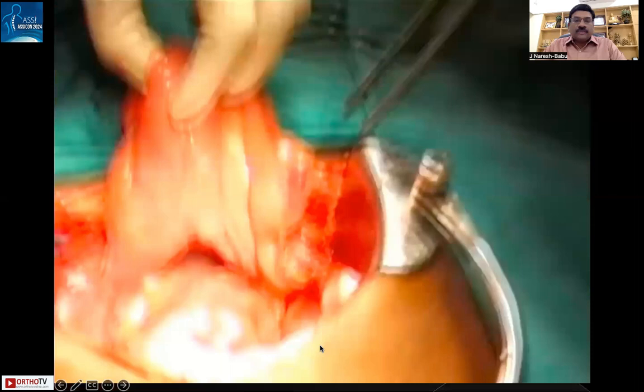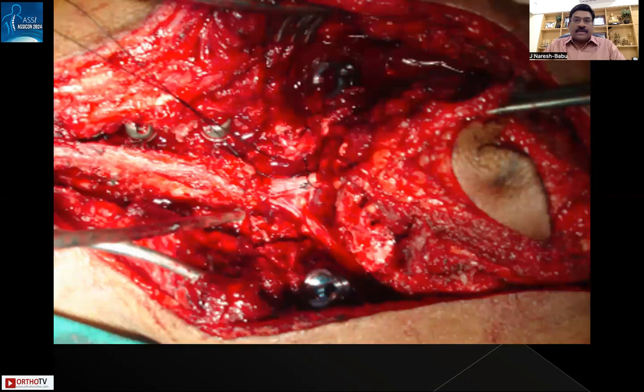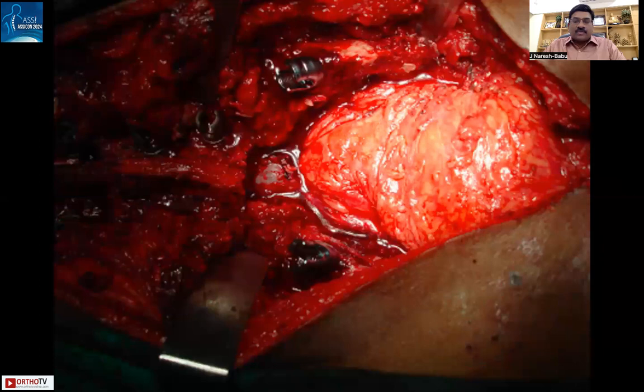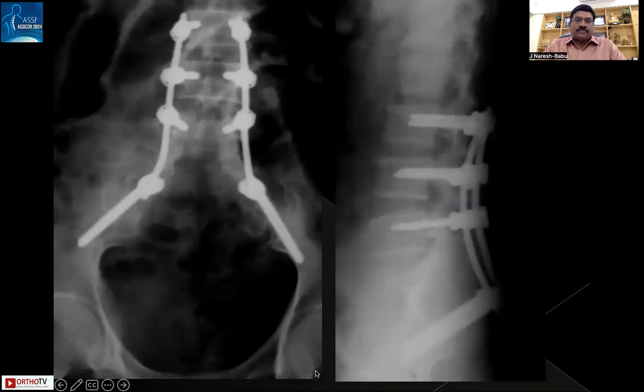Posteriorly, after exposure and placement of bilateral pedicle screws, the tumor along with the biopsy track is separated. The critical step is ligating the thecal sac to separate the tumor from the spine. Once this is done, iliac screws are applied so that spino-pelvic fixation can be completed and the entire tumor can be removed.